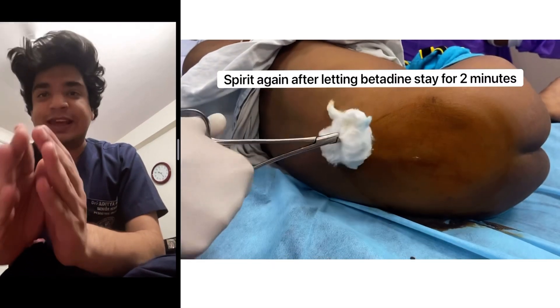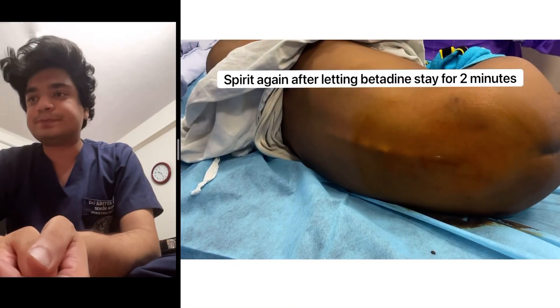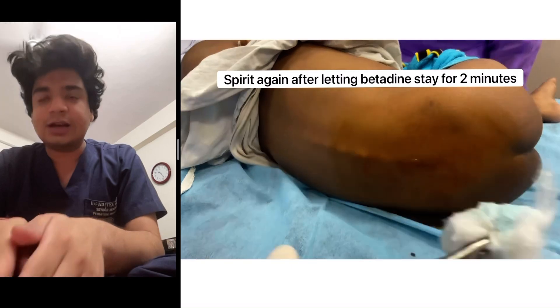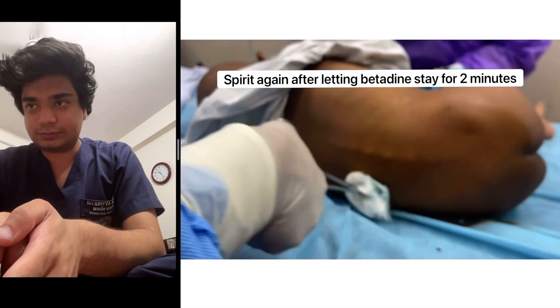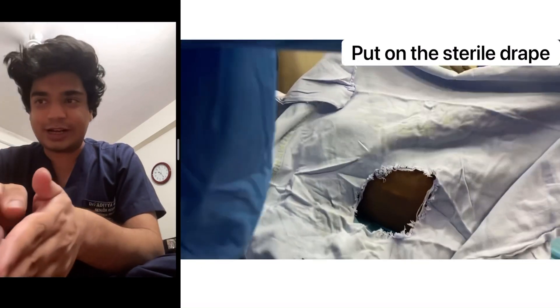Always make sure you let the betadine stay for at least two minutes before applying the spirit again. After cleaning the local area to avoid infection, put on a sterile drape on top — this is me putting on the sterile drape.